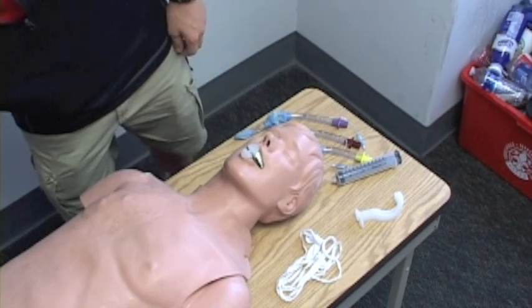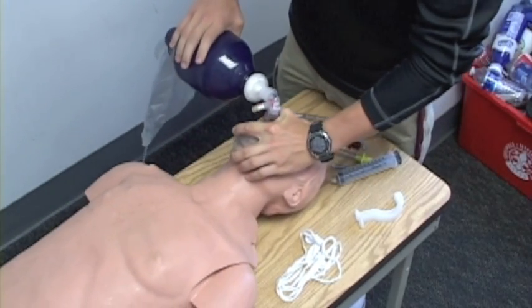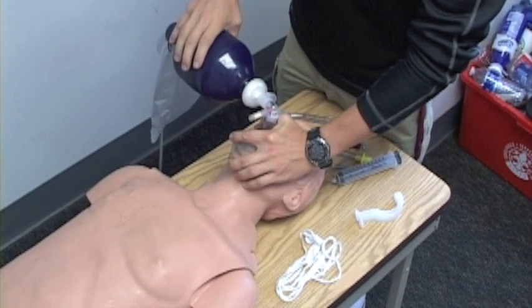We're going to use the properly sized bag valve mask to provide ventilations for my patient. We're going to get an EC clamp, head tilt and chin lift, and watch for proper chest rise. We're going to breathe once every five seconds for my patient.